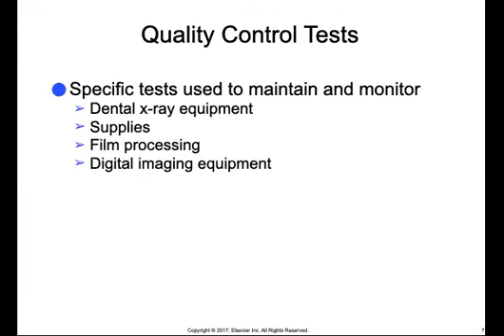To avoid excess exposure of patients and personnel to X-radiation, the dental radiographer must have a clear understanding of the quality control procedures used to test X-ray units, supply film, film processing, and digital imaging equipment in the dental office.